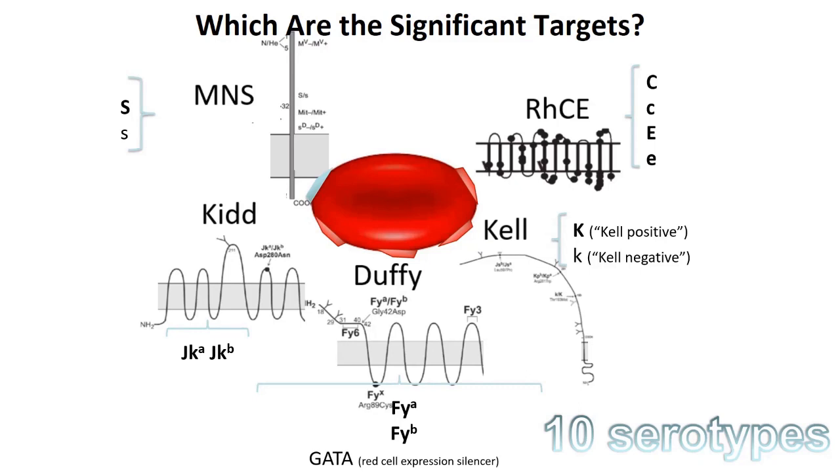These are the practical antigen determinations that we can therefore prepare in giving to a patient the best possible or highest fidelity blood match, should such a justification exist.